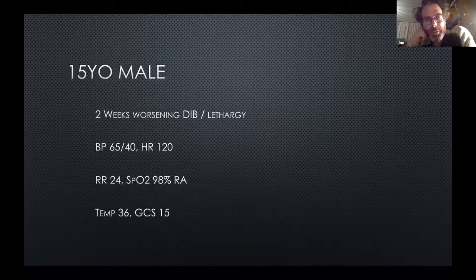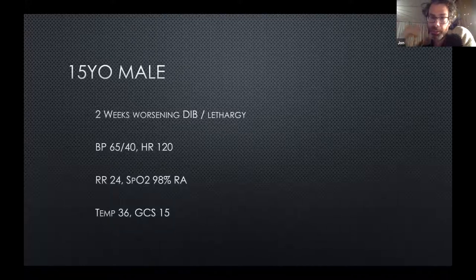I was asked to see him by one of the PEDS EM consultants. I wasn't doing PEDS, they just happened to know I was around, and they thought an ultrasound might be useful because it was basically a case of undifferentiated shock. They had no idea why his blood pressure was low. There was quite a broad differential.